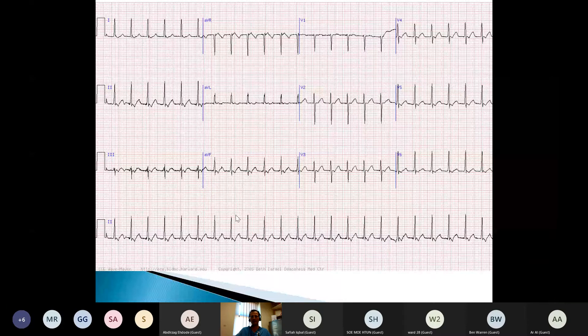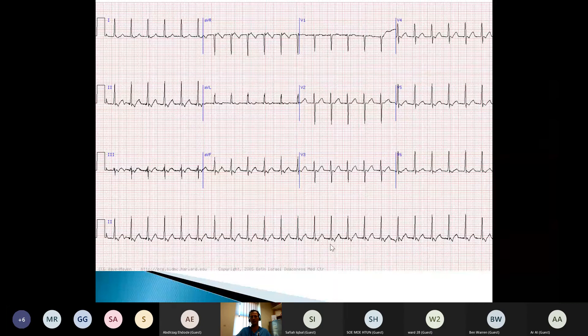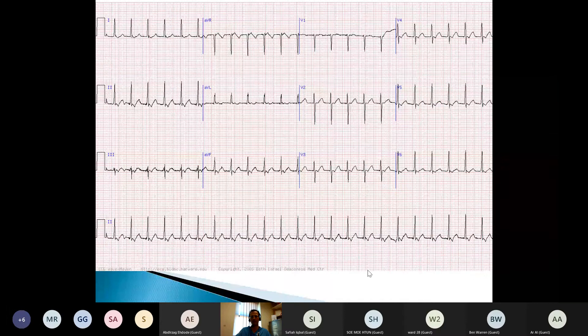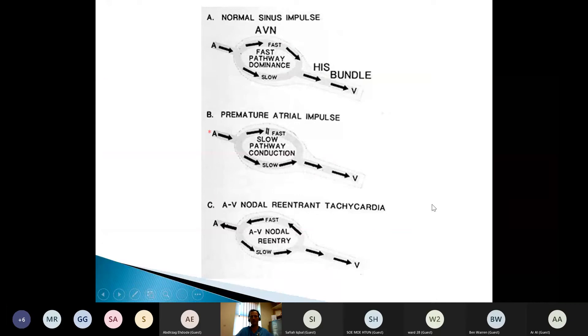This is highly suggestive of an AVNRT. The other thing it could be is an atrioventricular re-entry tachycardia — I'll talk about that another time. But for now, I want to tell you a quick bit about AVNRT. They're common — a common reason why people do EP studies and ablations. Probably about a quarter of people have the capacity to develop an AVNRT. The way to make the diagnosis is to give some adenosine and look at the ECG and see that it terminates, or you could do Valsalva or carotid sinus massage — obviously care with carotid sinus massage.